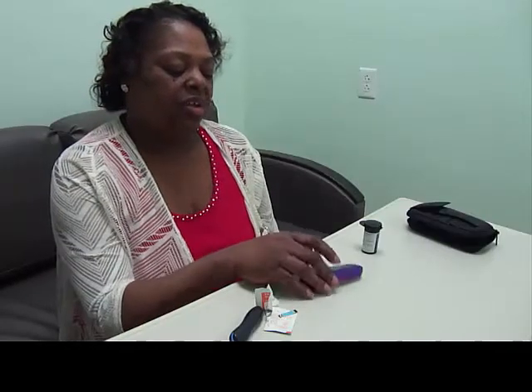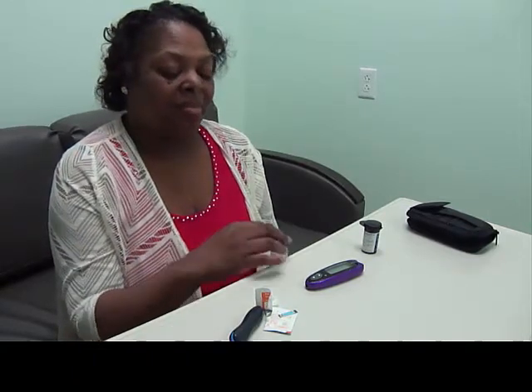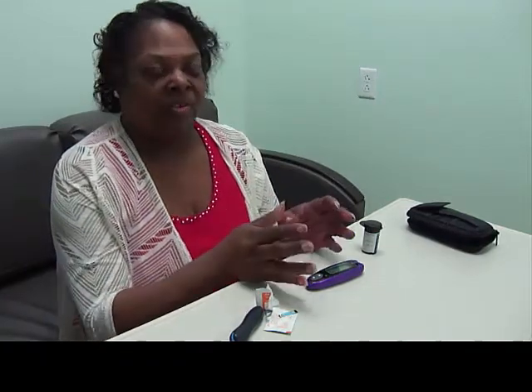Some of the machines, or maybe all of them, store the readings in there, but you really don't want to rely on that in case the battery goes down. But you've got it written down, so you have that. Also, I wouldn't let somebody use mine, because that messes up your data, since you've got yours and theirs in the machine.